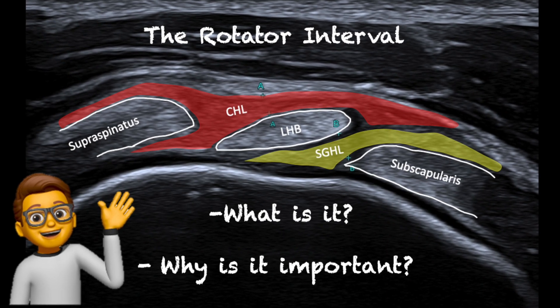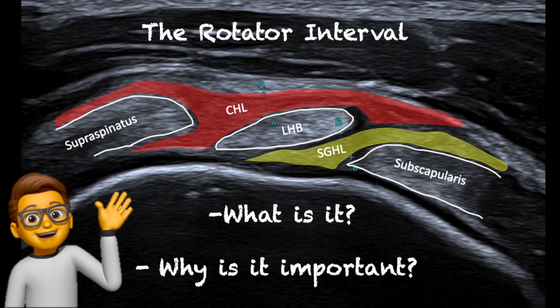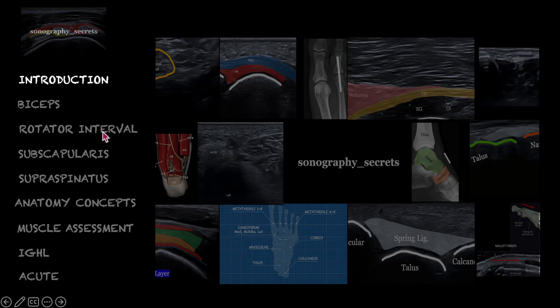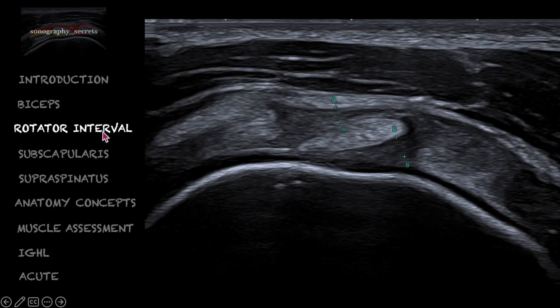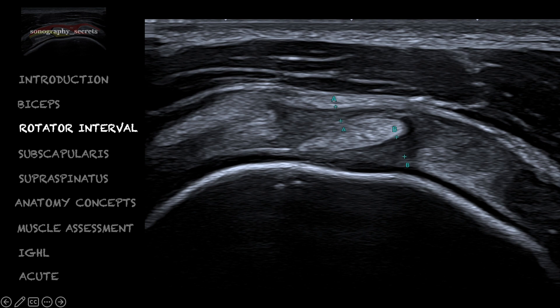There are essentially two main reasons why we need to know about the rotator interval from an ultrasound perspective. First, we need to know what it is. The rotator interval is a complex anatomical region that plays an important role in the stability and function of the shoulder. To identify it, we look at the most proximal aspect of the biceps, just where the bicep sits up and off the humerus.